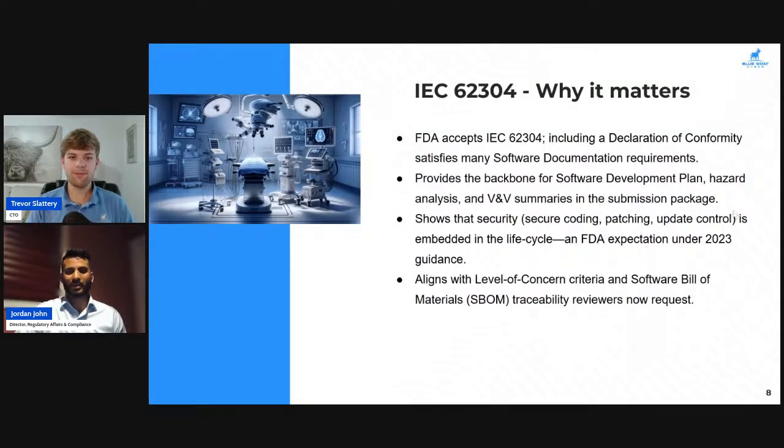Correct. Yeah, absolutely. If you've been in the medical device industry, this method is defined. It's just a different topic, really. That's the way to treat it. Cybersecurity is a whole new topic, a new risk category that wasn't emphasized as much in the past, but now it's obviously very important and a high priority for the FDA and customers alike. So that's exactly it, Trevor. You need to go through that whole process, document everything, make sure you're tracing back to your risks and specs and verifying everything and anything to do with this.